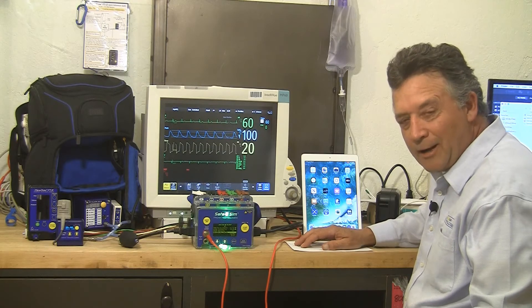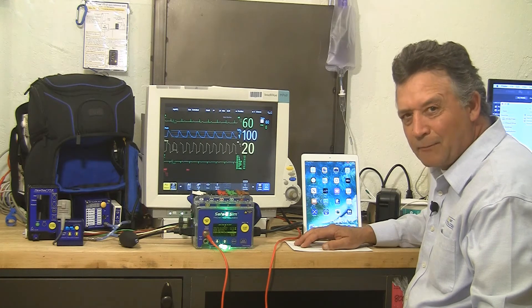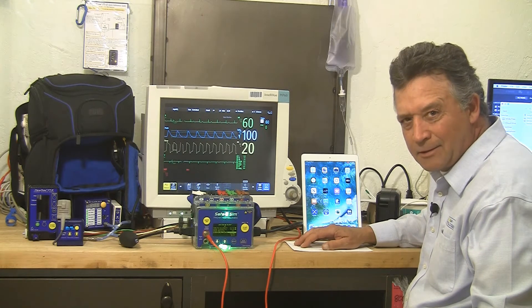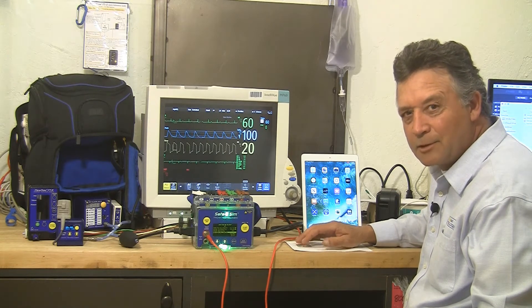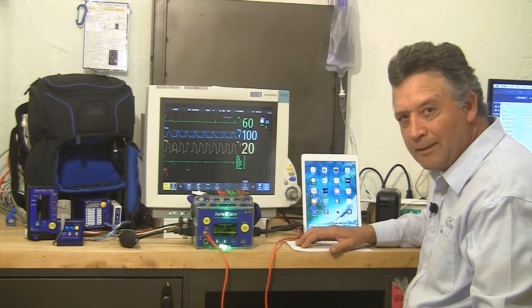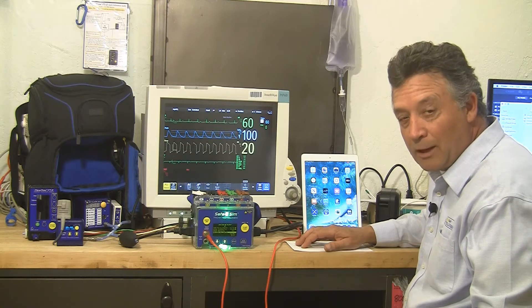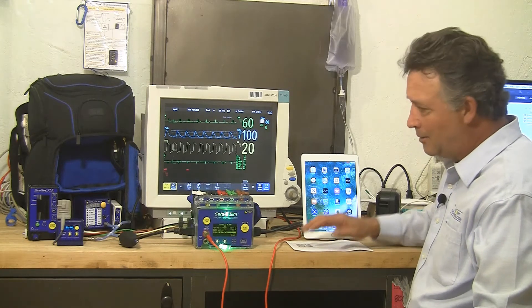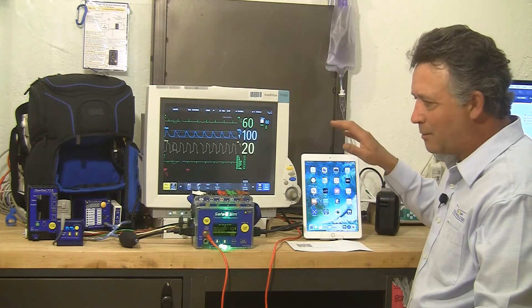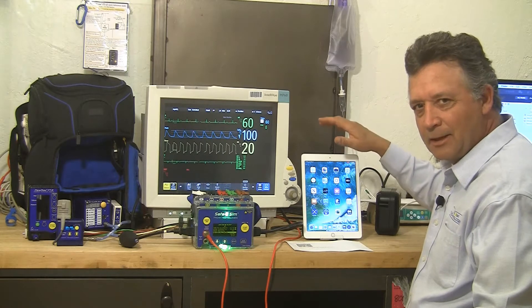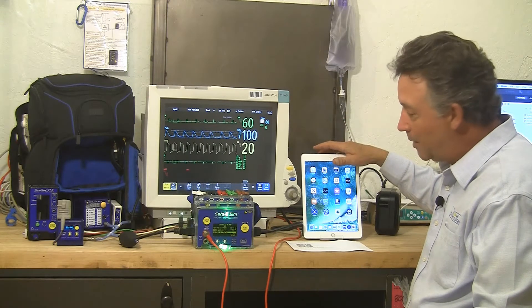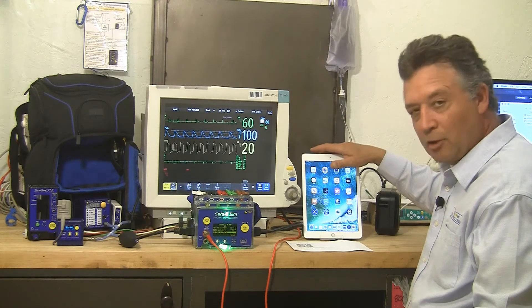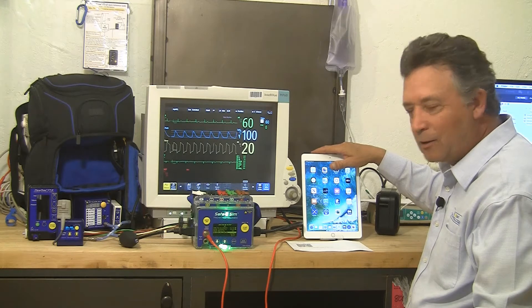Hi, I'm Greg Alkire, VP of Sales and Marketing from Pronk Technologies, and today I want to take a few minutes to show you something new we've been working on called Mobilize, where you can take all of your test equipment from Pronk Technologies and control and capture from it from your iOS device, either an iPad or an iPhone.